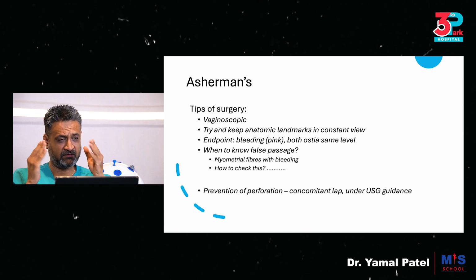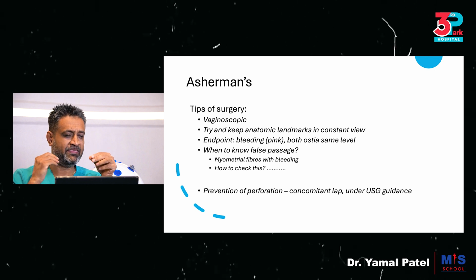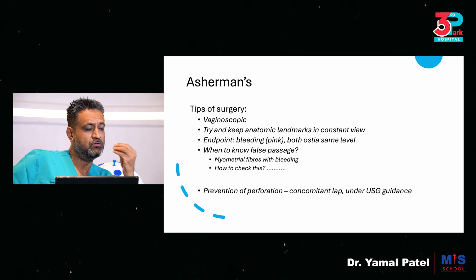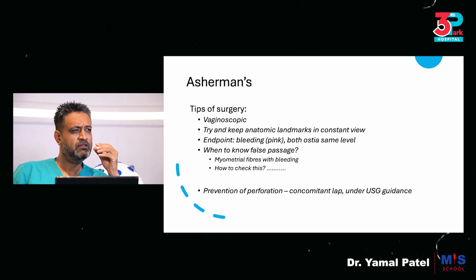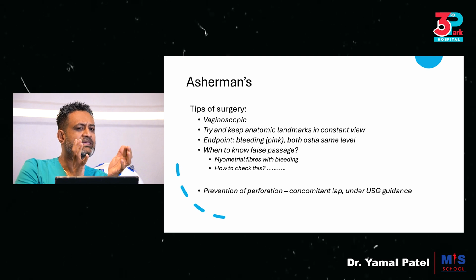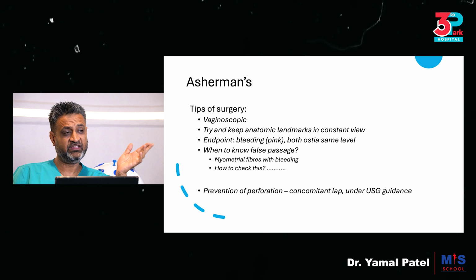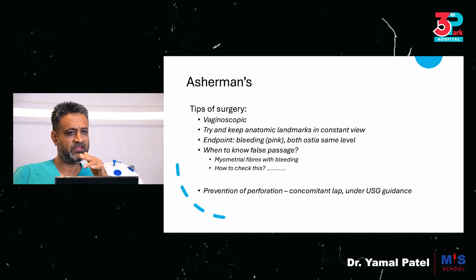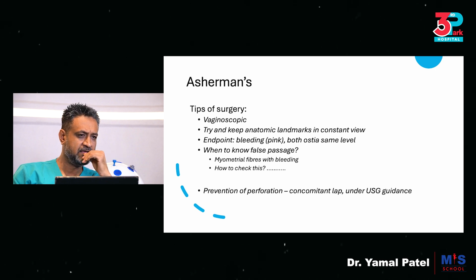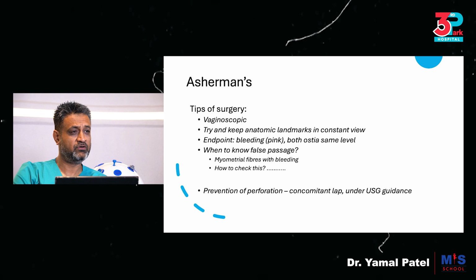So know your landmarks, know how the internal cervical canal should look, know that now I think I am at the internal os, this was the external os, know that this is looking like I am within myometrium, so it guides you. It will give you guidance. Keep the ostia under vision. Make sure that your aim is to bring it to the same level. So basically speaking, having certain anatomical landmarks is very important.